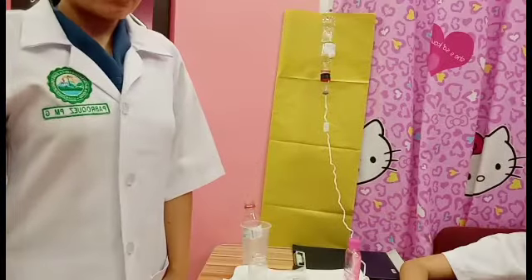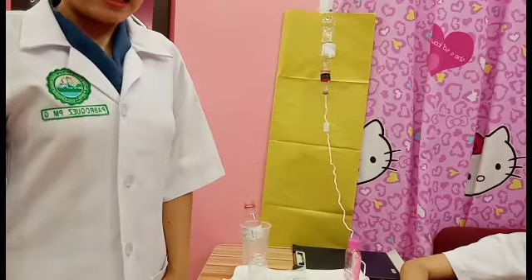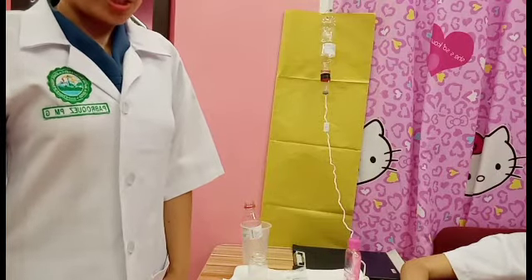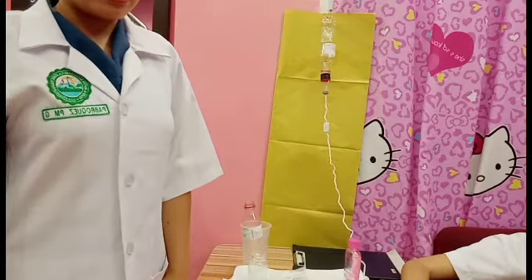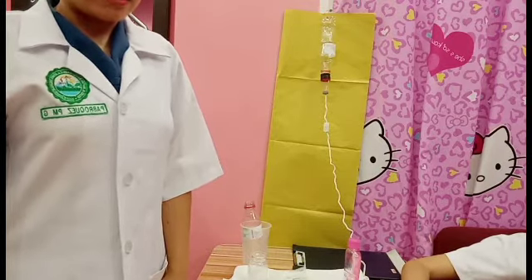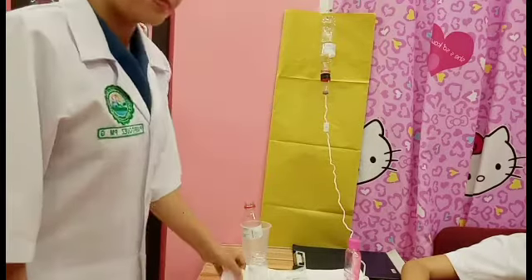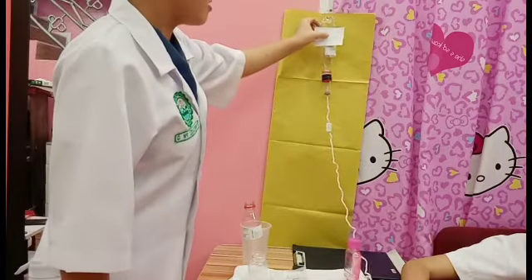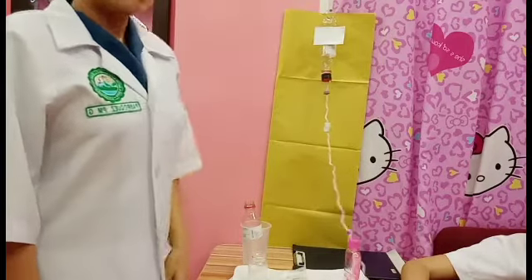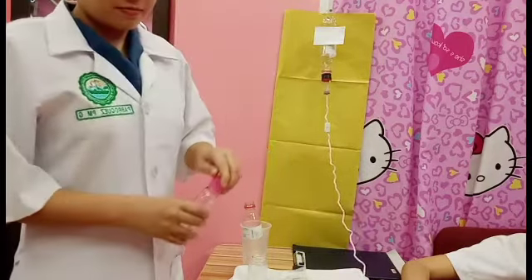Next is to label container according to agency policy. Indicate the time and date, drip rate, name of the patient, type of IV solution, and incorporation if there is any. Discard used equipment in proper manner. Next is to perform hand hygiene.